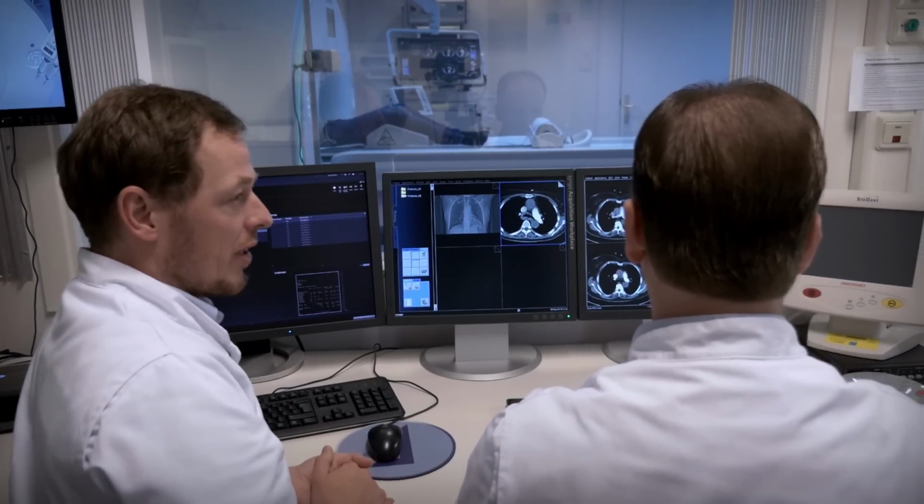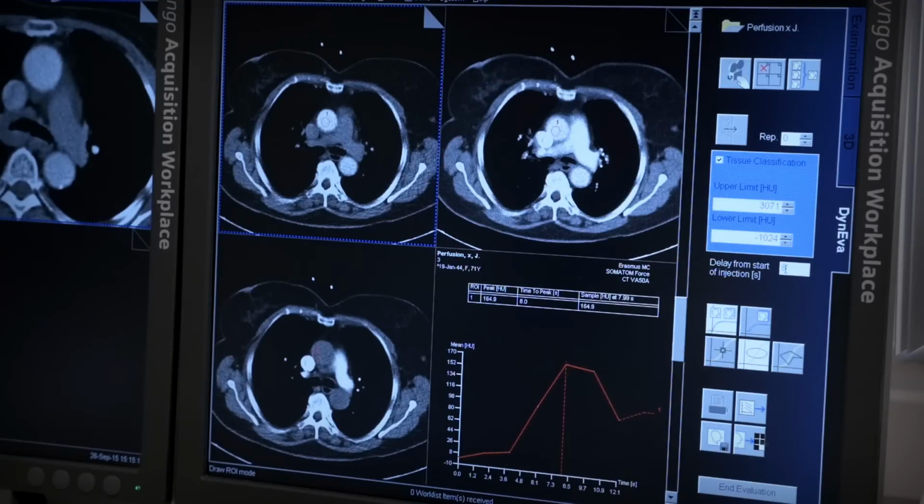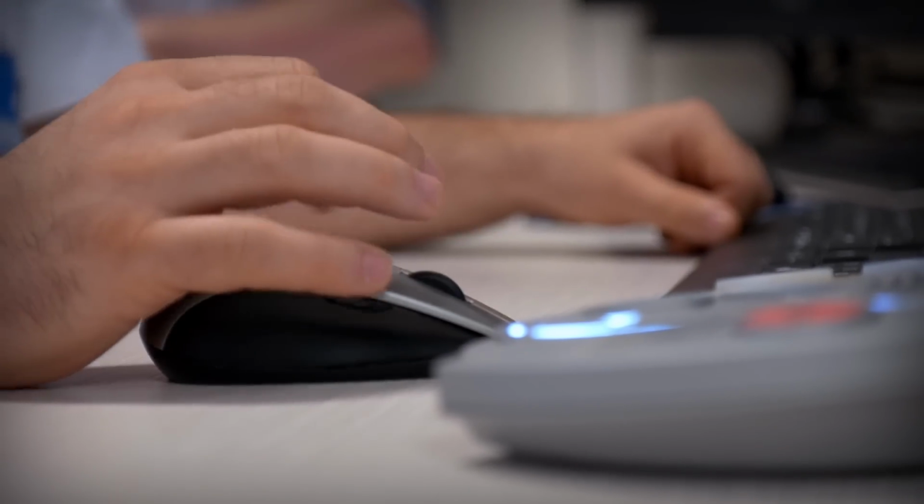We start off with a topogram and often a calcium scan. If the calcium scan is acquired during systole, we can use it to plan the subsequent scans. In addition, we will also do a test bolus. This allows us to plan the bolus during the perfusion scan.